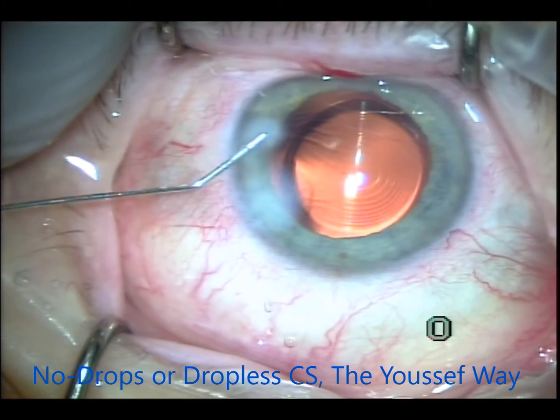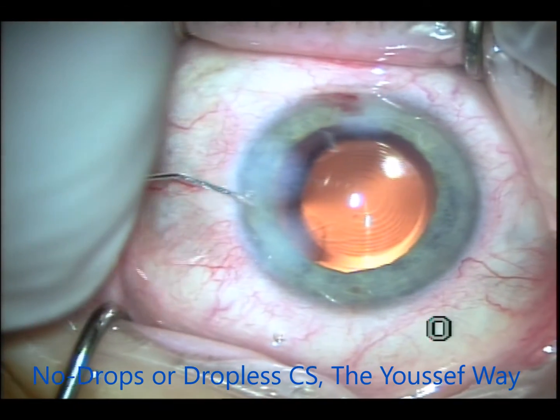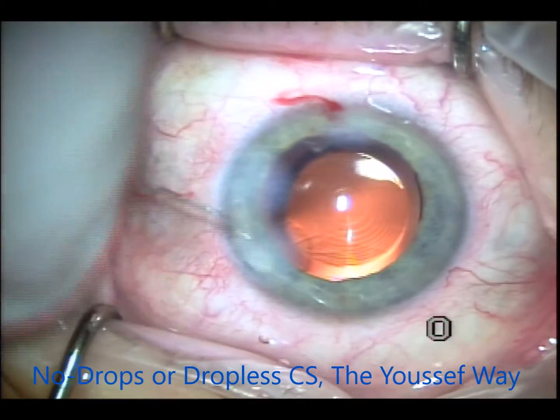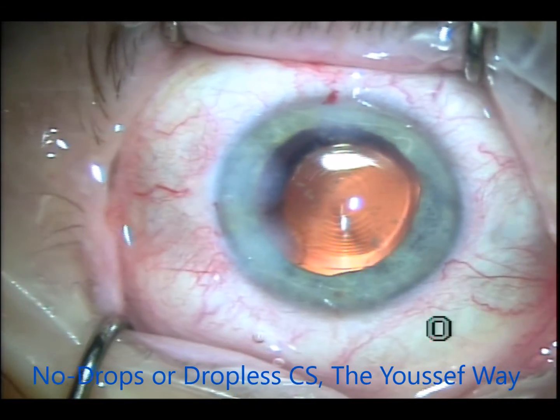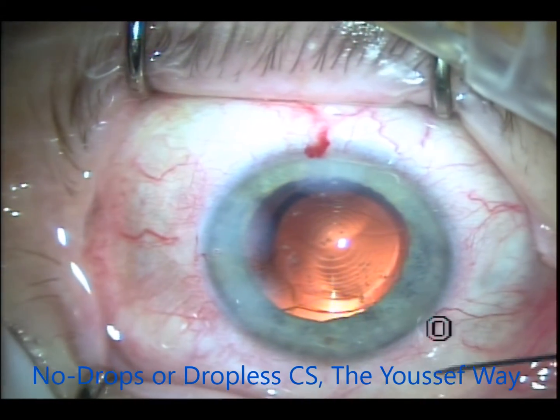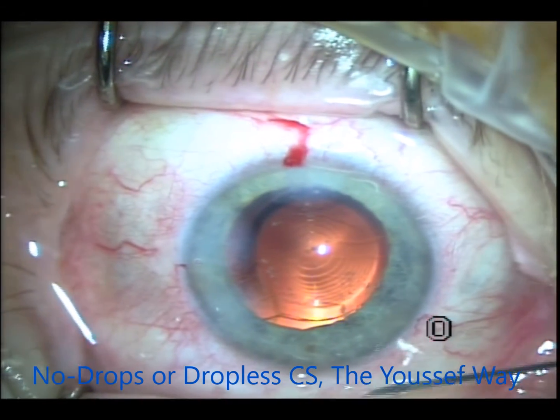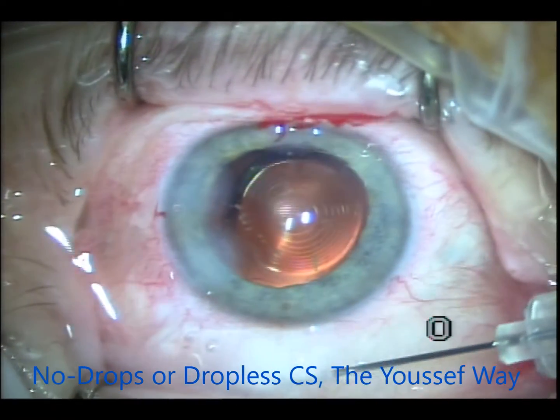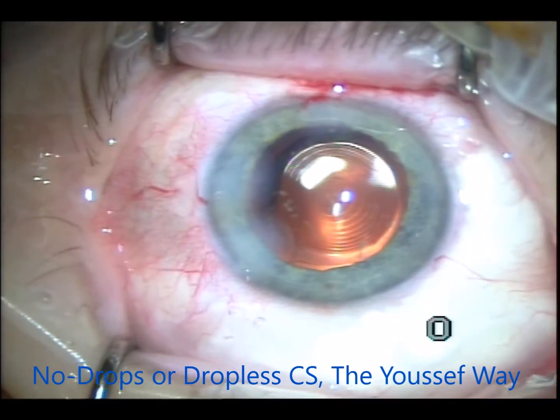I'll go through another case — same thing. The moxifloxacin is injected to hydrate the wounds so they become self-sealing: the main wound and the paracentesis. It's another Symphony lens implant — injecting into the sulcus, into the bag, and into the anterior chamber. Then the rest is placed on the surface. Next is the Tri-Moxie, which is a long-acting steroid and moxifloxacin. Instead of injecting it into the Berger's space, I inject it in the subconjunctival space where it stays for a few weeks after surgery.